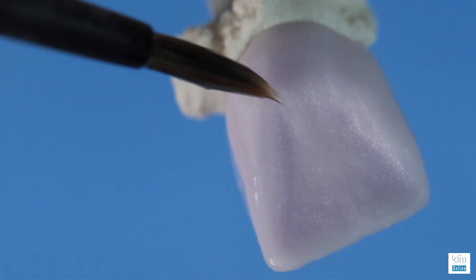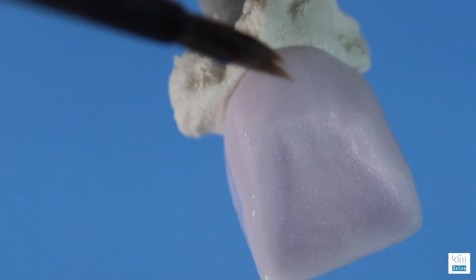When adding glaze to the proximal surface, thin it over the contact zone. By doing this, we won't see binding when we seat the restoration.